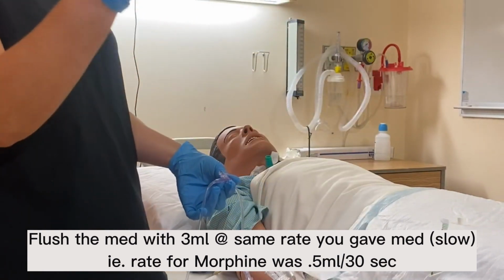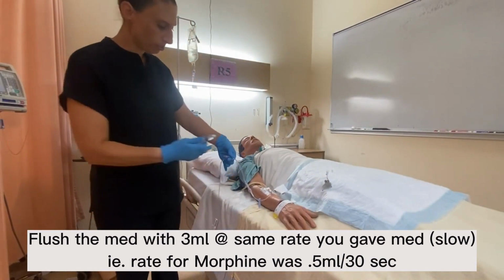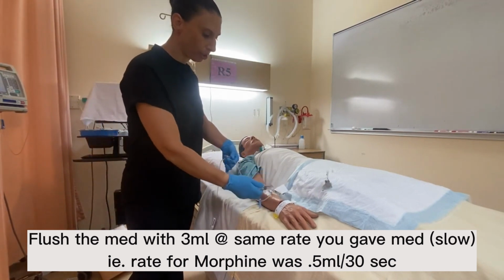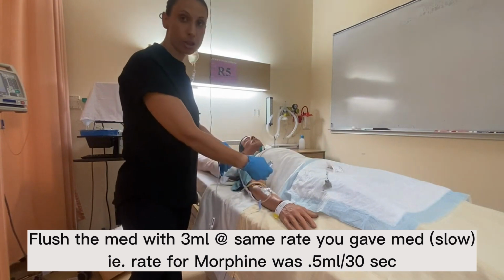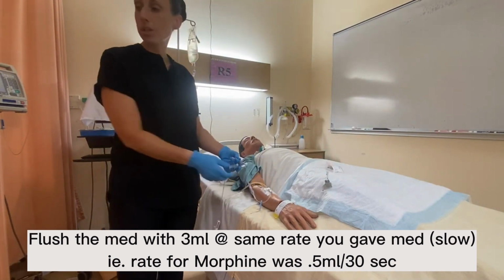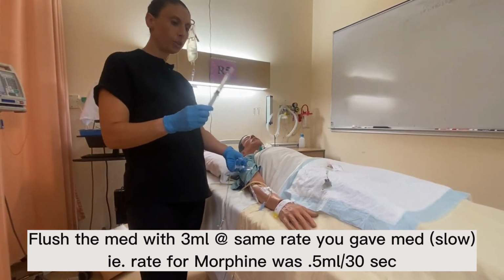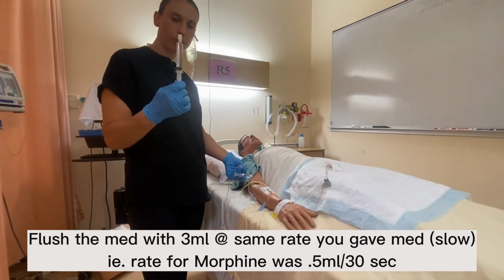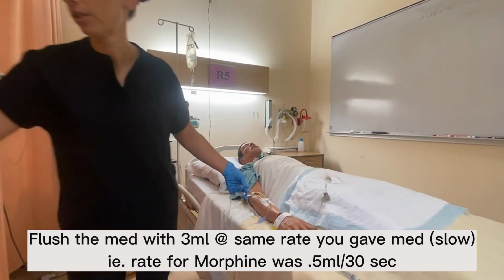Okay. So if we put our port down, we would just make sure that we re-swab it. And I can use a 3 ml syringe here. 3 mLs is actually perfect because that's about the correct amount that is inside this tubing, 3 mLs from this port all the way to the patient. You could, if you wanted, use a larger syringe. So if you only had 10 mLs, that would be fine. You can just infuse 3 mLs from here and then discard the rest or do a flush with the rest.